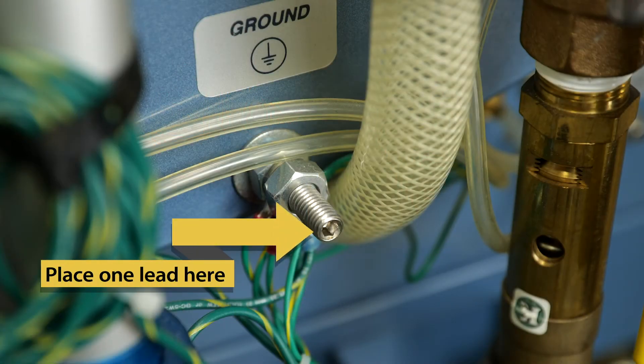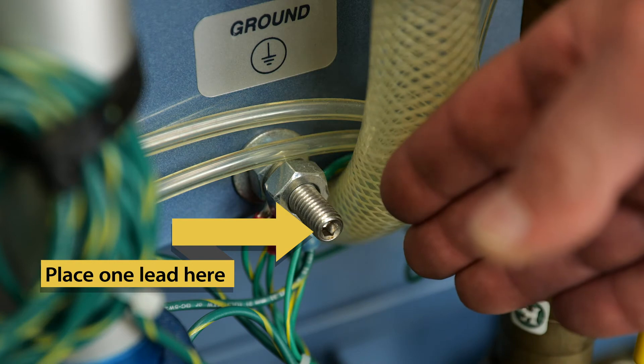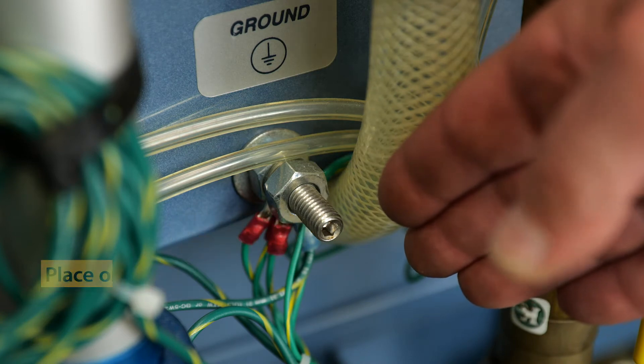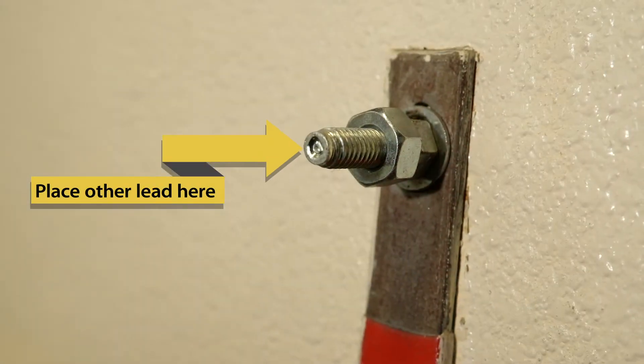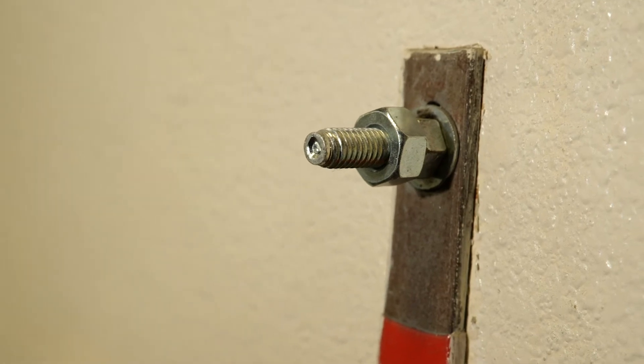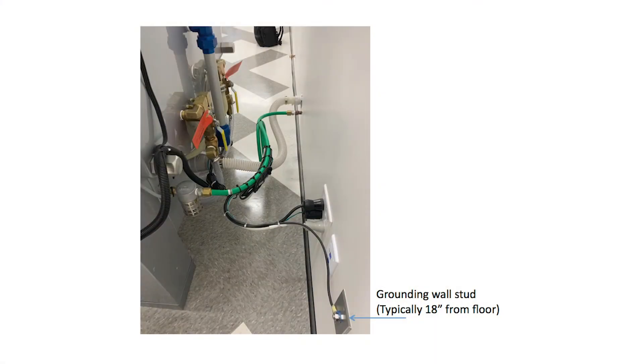To check the chamber ground on a chamber without the test point kit, you want to measure with your ohm meter between the stud on the back of the chamber and the stud coming out of your wall. You will measure between those two studs, and you should have less than one ohm.